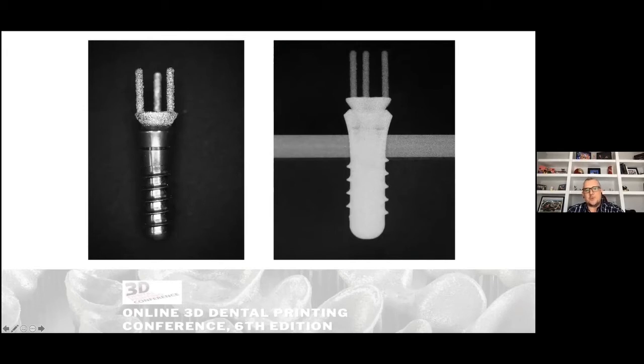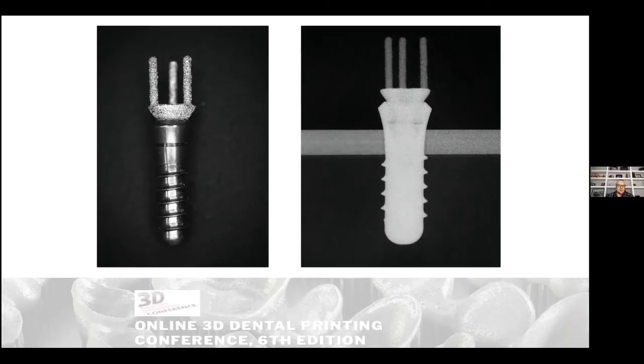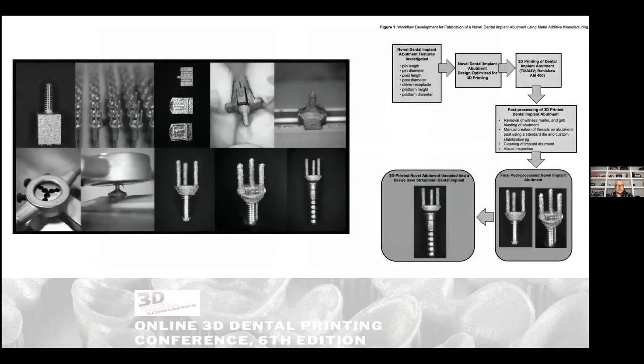And then each one went through a radiologic assessment. What we're looking for is essentially no gaps to seal. In an oral environment, if we have gaps, that's going to lead to some microbiologic issues, and it's going to compromise our end result.